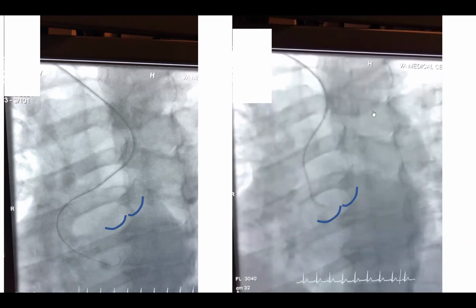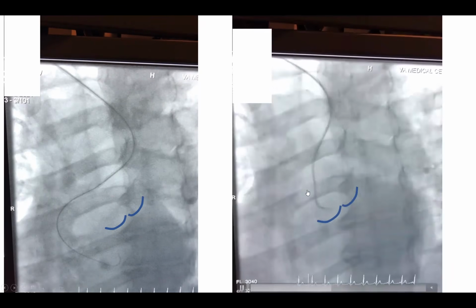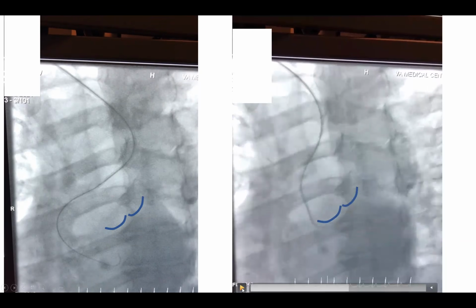Okay, we tried to jump, and as we're trying to jump, the catheter is about to fly out. This is a time to rethink quickly. I don't want this catheter to fly out. It wasn't easy at all to get it down. If it flies out, it may be the end here.